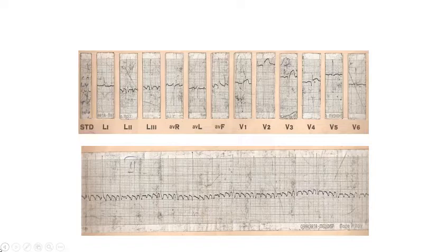There is myocardial infarction, sir. Yes, this patient has evidence of a recent myocardial infarction because ST is still elevated, and there are Q waves in V1, V2, V3, and also V4 with ST elevation. So it is a recent anterior myocardial infarction, which is the cause for atrial flutter.